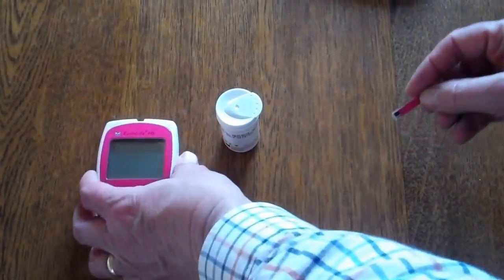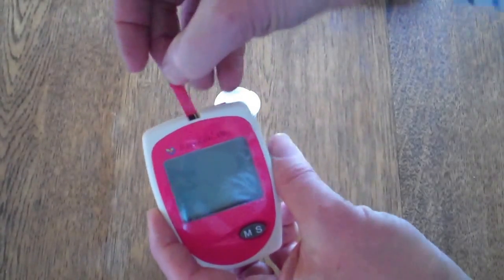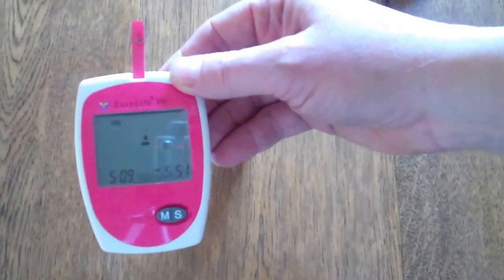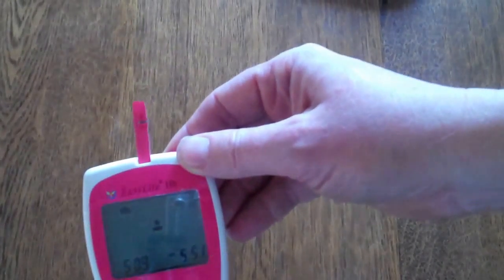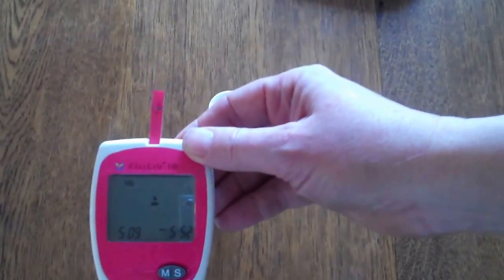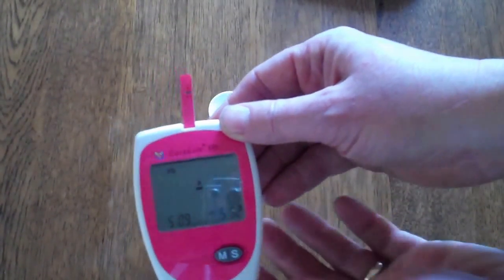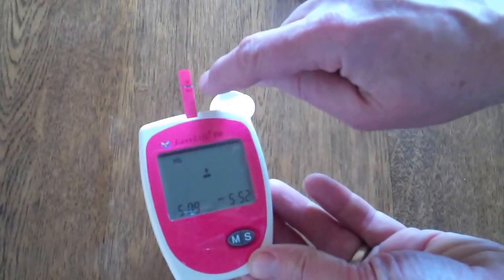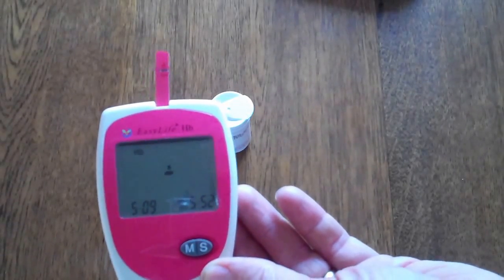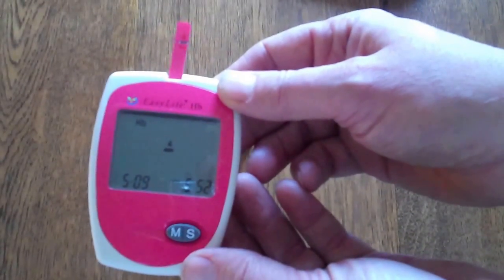To operate the test meter, simply take a test strip out of the pack when you're ready to perform a test and place it into the meter. You'll see the code reading is shown initially, then it indicates it's waiting for a blood sample. To perform a test, take the auto lancing device, lance a finger, and apply the blood sample onto the patch in the gap between the two elements of the test strip. The meter will automatically detect the blood haemoglobin levels and give you a digital readout on the LCD display.